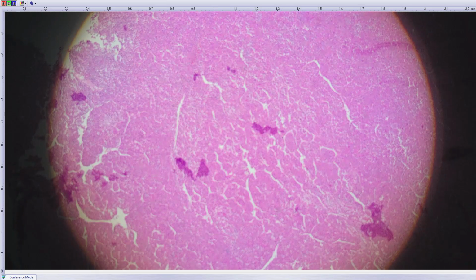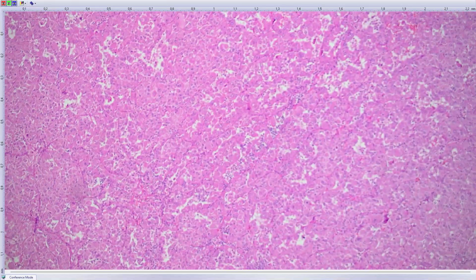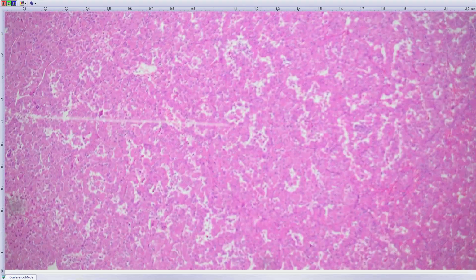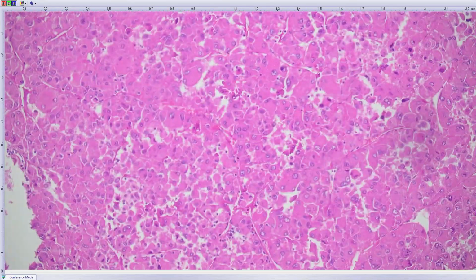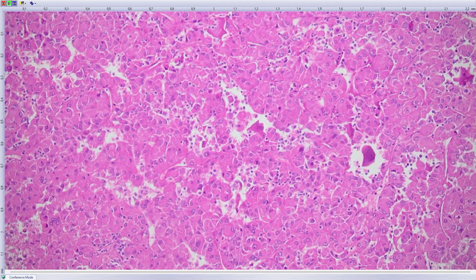And so the tumor was sequenced, and there was indeed a KIT mutation, so the conventional GIST KIT mutation, but at the same time there was a TSC1 mutation, which is typical for PEComas. So actually the pathologist was right with both differentials in a way. And I agree with him. This is from Jirka Soukup, he's an amazing pathologist. He didn't send it to me for diagnosis, he sent it just for pleasure, just out of interest.